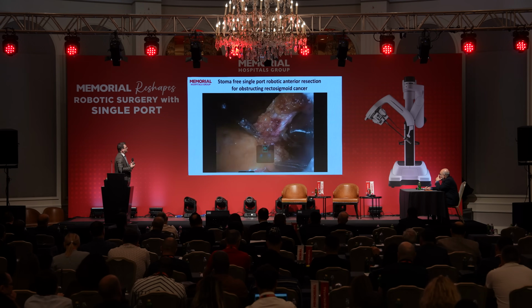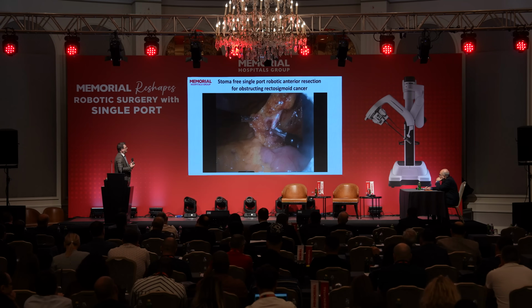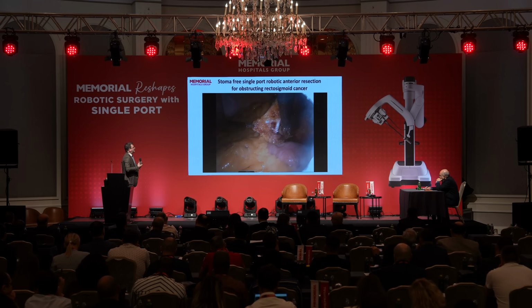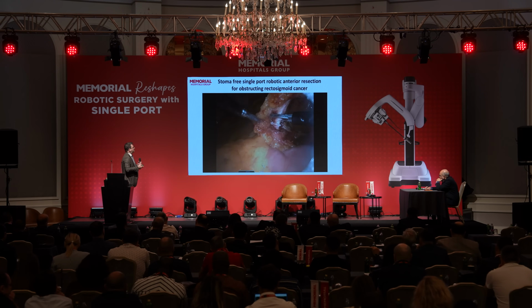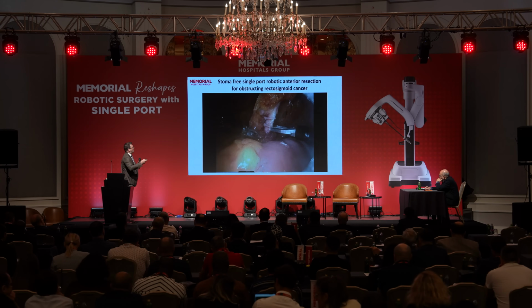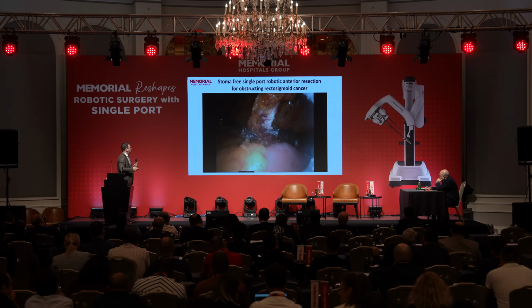Five millimeter Hem-o-loks are almost always enough for proper application. Two clips below for the artery. One clip is enough for the vein, because veins can sometimes be more delicate with clip application, so safety, of course, is always first.